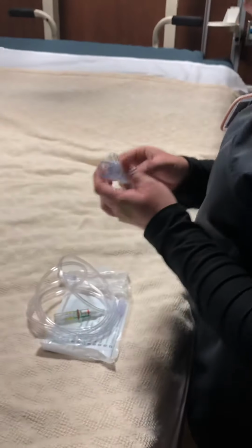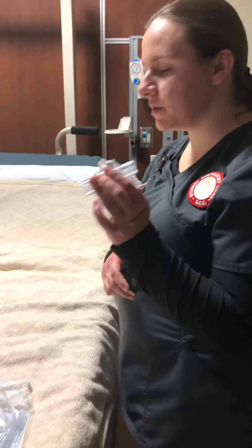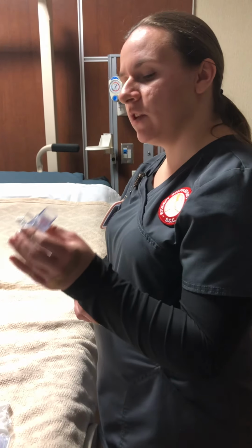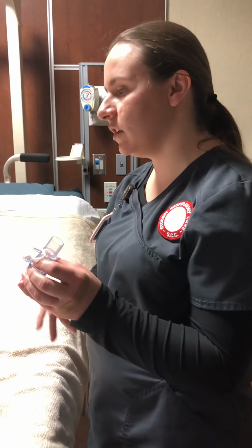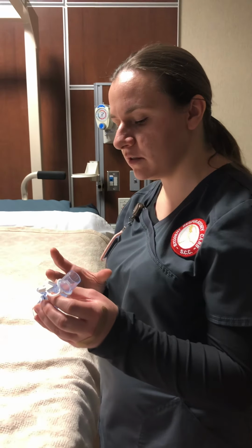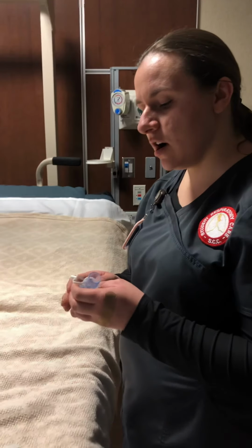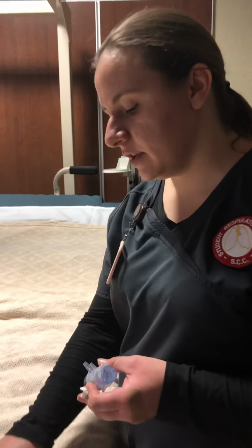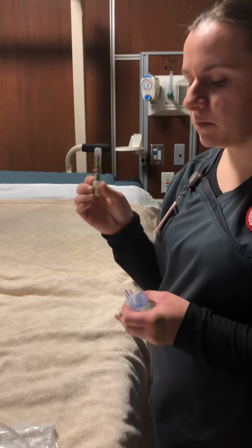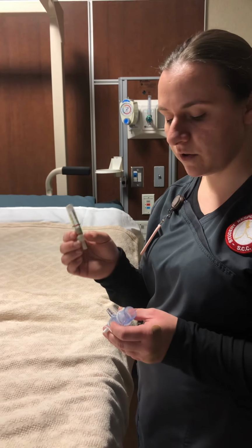So here we have the EZ PAP. It's just a little small device. If you can't quite do it, get your breathing with the mouthpiece, we can get a mask to place onto this. So here, I'm going to measure out their inspired volume. So I'm going to take the pressure manometer so that way I can see where they're at.